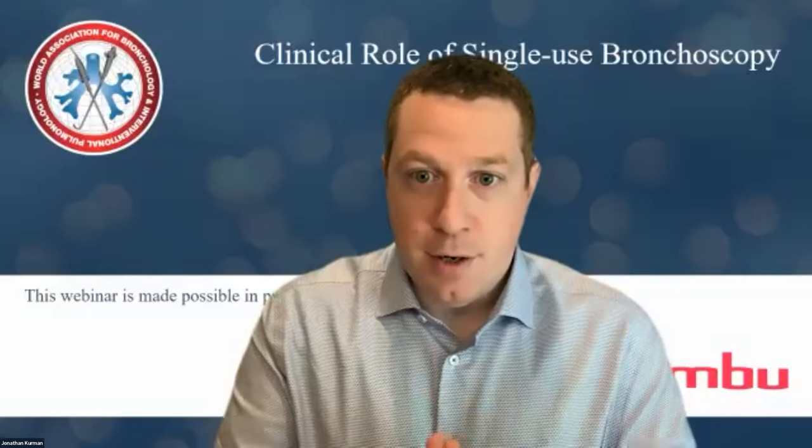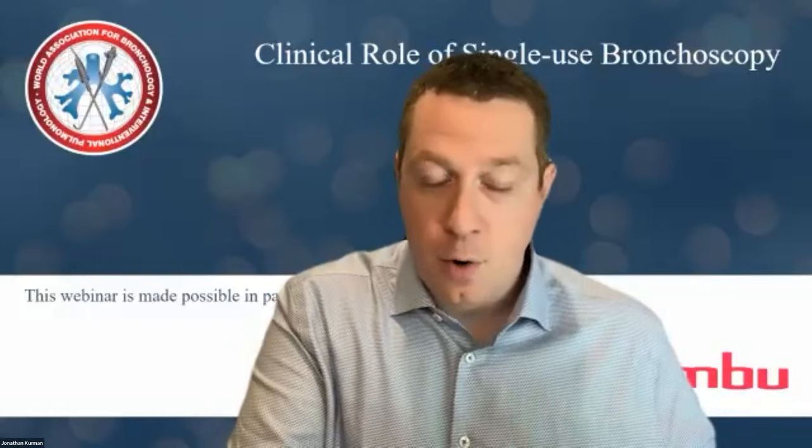And I think how we can accomplish that on a small, realistic scale is pick a given procedure, do a series of cases with the single-use scopes, do a series of cases with the reusable scopes, maybe randomize 1-to-1, see if there really is a difference. Is the complication rate higher with one? Is one taking longer than the other? Are the outcomes different?